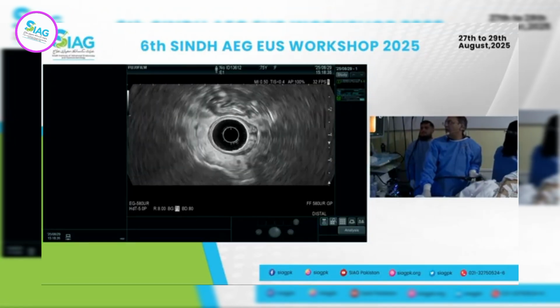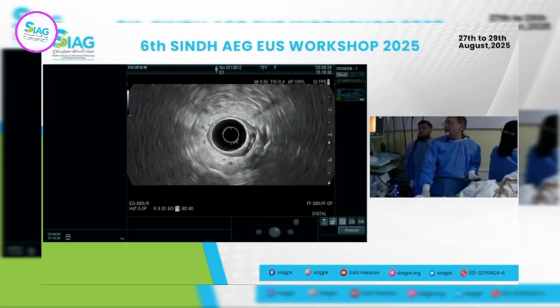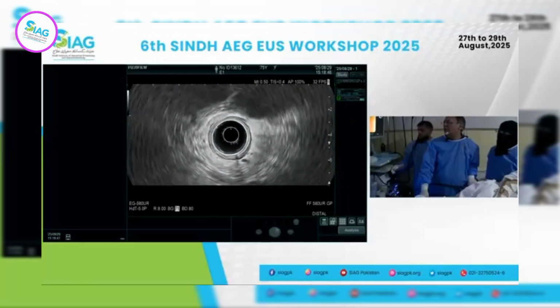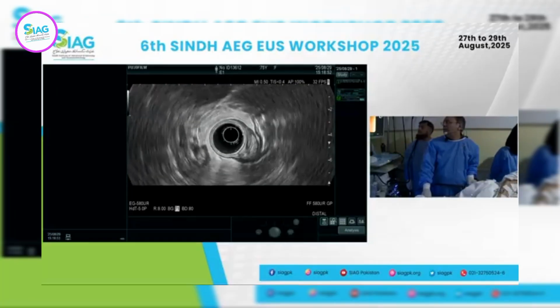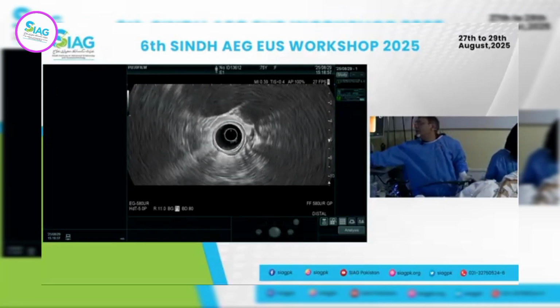My goal is to find the bladder and bring that to the top. Right now there is another bowel lumen on the top, so I'll come back a little bit further down and see if I can find the bladder. You see the black structure on the top that looks like a bladder? Right there. Let me make the image a little bit smaller.